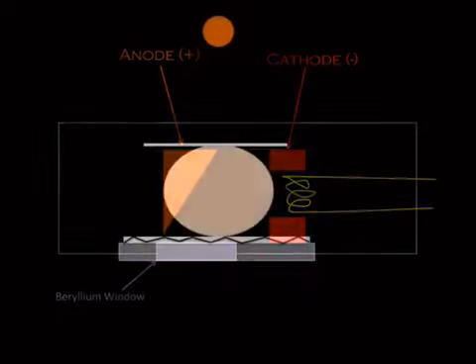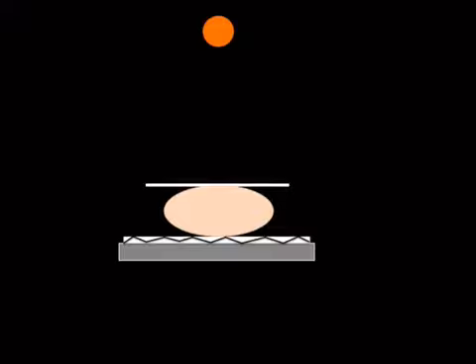All right, so here's another concept in breast imaging, is that the breasts aren't just thrown down on the plate in X-ray, they're compressed, right? And there's a whole bunch of different reasons why they're compressed. The reduced breast thickness means there's going to be less scatter. And if you remember from our prior lecture, a thicker body part will have more scatter, so a thinner body part will have less scatter. Also, this allows for a lower KVP to be chosen.